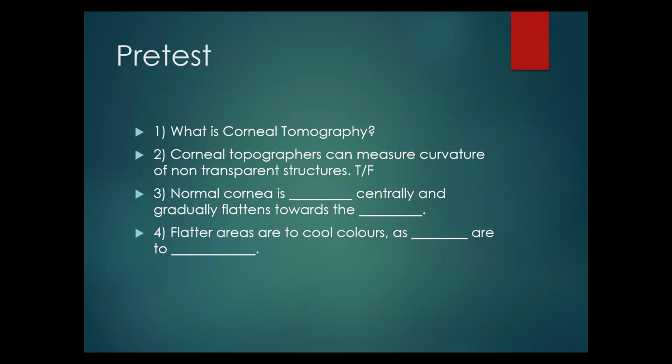Because when you talk about tomography, we're talking about sectioning, either from the top to the bottom or from the anterior to the posterior. But it has to be a cross section of the whole image that we are talking about. That's my understanding. From the way you are explaining, I think we are practically talking about the same thing.